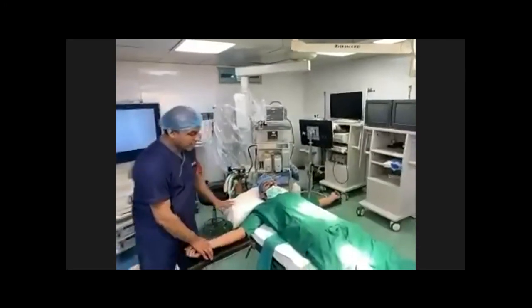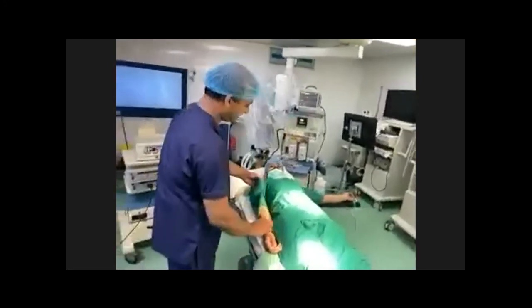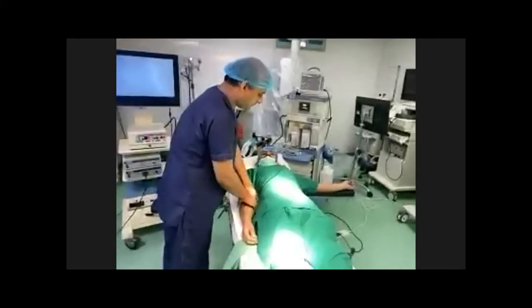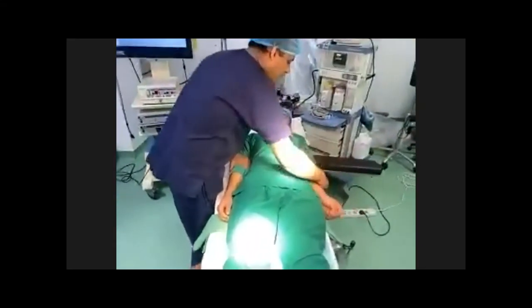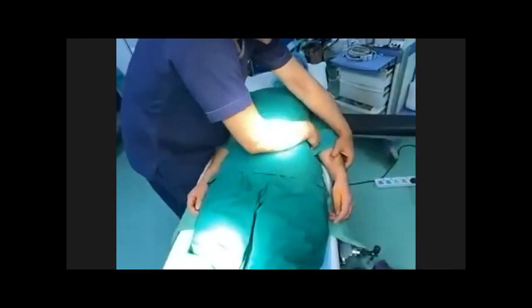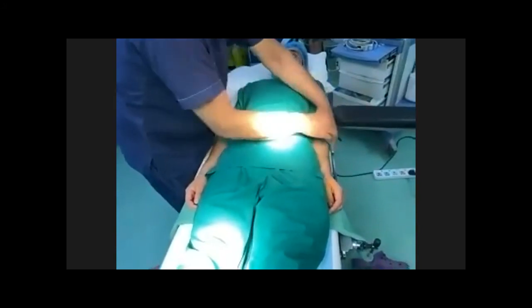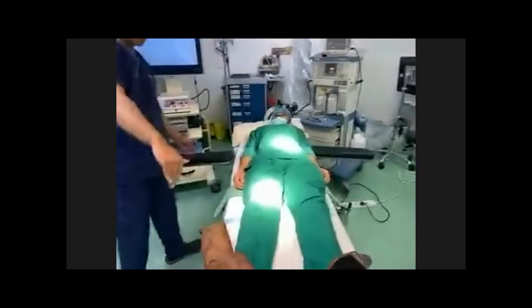The other way is to put the arm inside and tuck in the arm. We can do it on one side, and we can do it on both sides. In this way, you get a better position and more space for the surgeon and for the assistants to assist.